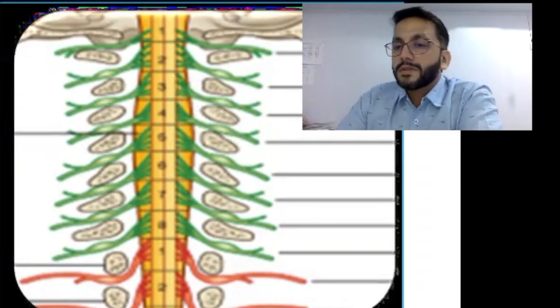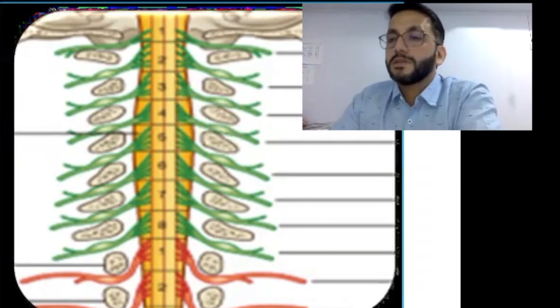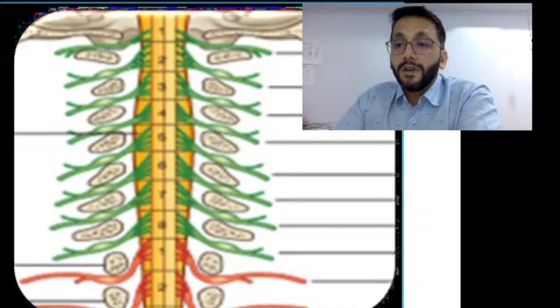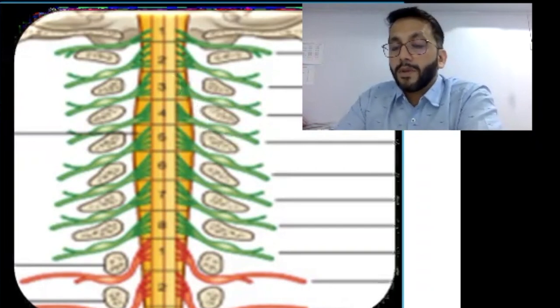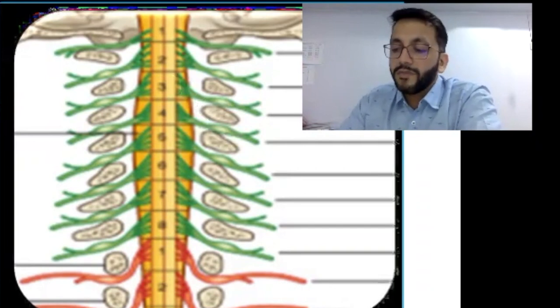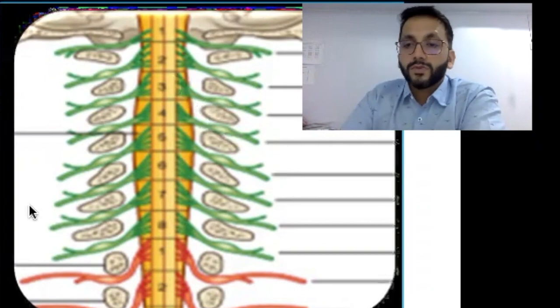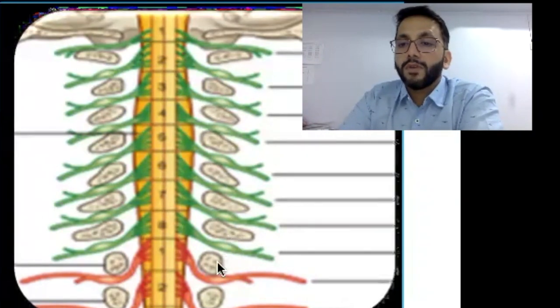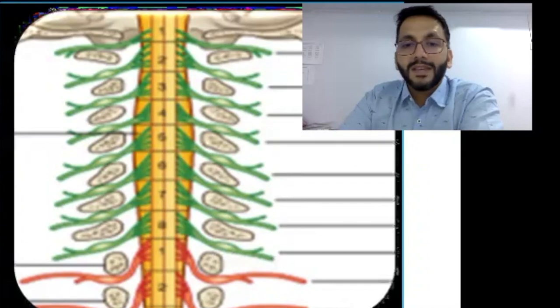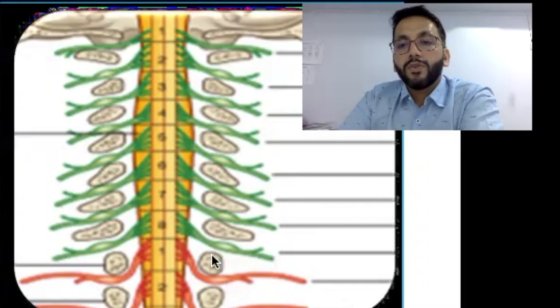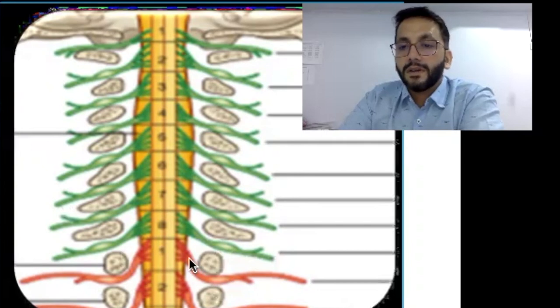The nerve coming out from the C6-7 neural foramen will be the C7 nerve. From the C7-D1 neural foramen, there is an additional nerve coming out which is the C8 nerve. So this is the C7-D1 neural foramen and the nerve coming out is the C8 nerve. From D1 neural foramen onwards, the D1 nerve will come out.